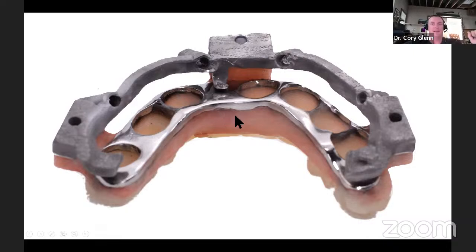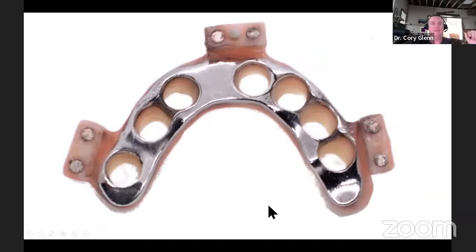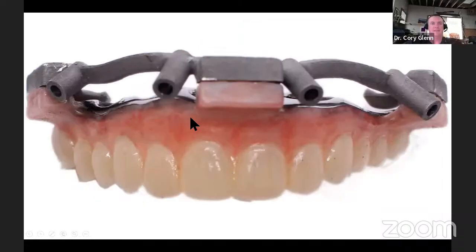All right, so that's the idea there. And again, here you see nice mirror finish on this. But again, imagine that this implant right here had to get scooted over by 2 millimeters. Well, okay, big deal. I'll have to adjust through a bit of metal, but it's only 1 millimeter thick. The rest of this is resin, so that's going to be easy to adjust through. So that was the concept of why I did the temps like this.